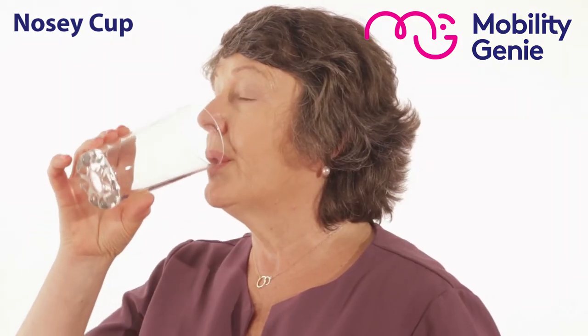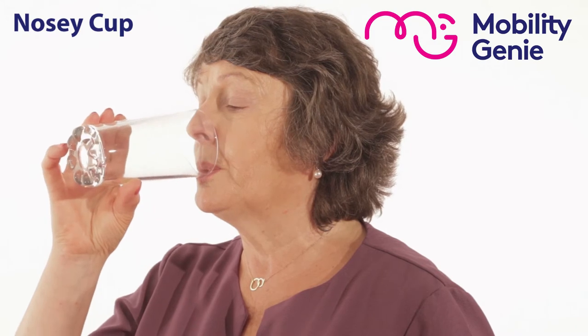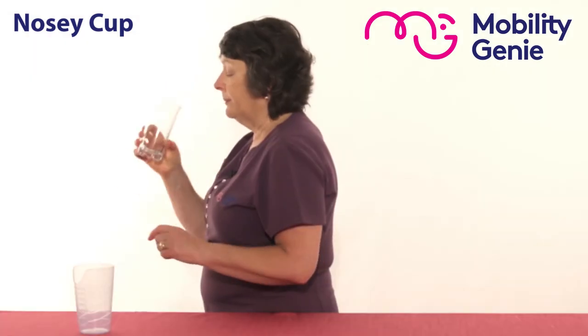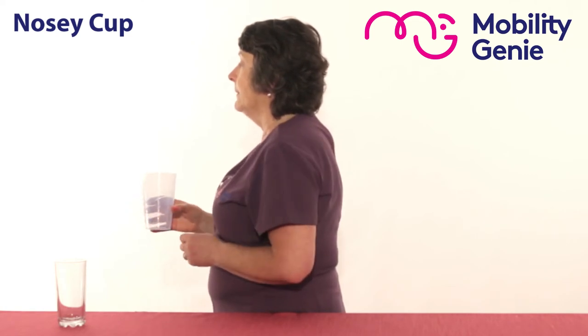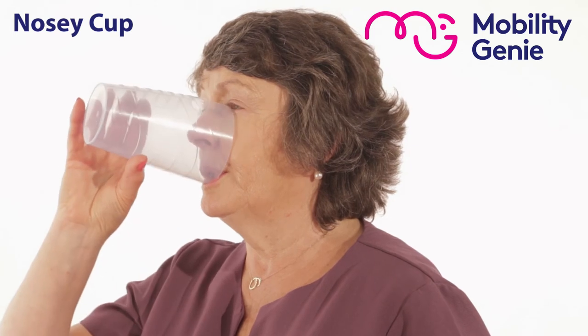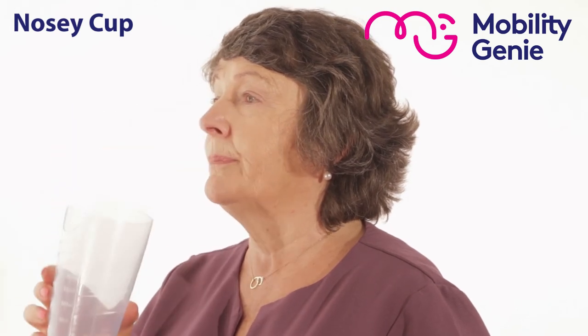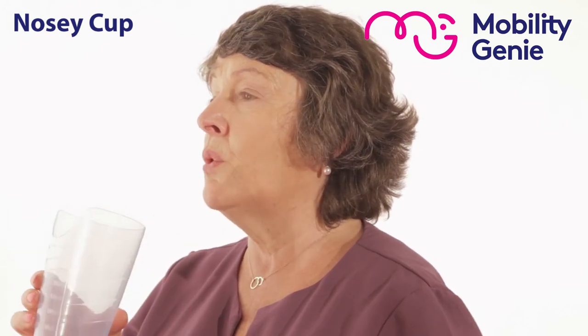So here we are and you'll see my nose getting in the way. There's no way I'd be able to finish the fluid in that glass. Remember, I have to keep my head and neck in the one position. So again, it allows the nosy part of the cup — the cutout part — to go over my nose.